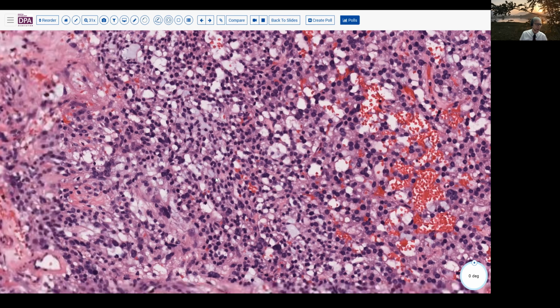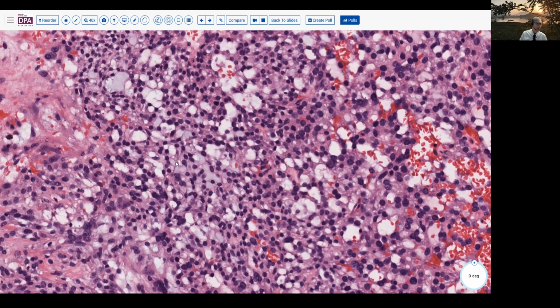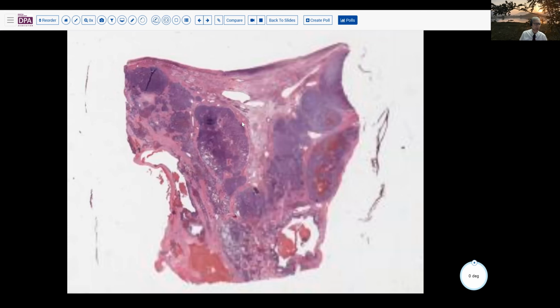We might wonder about epithelial differentiation, given a sort of bluish color to some of the cyst contents. So certainly a possible masquerading tumor with epithelial differentiation would be considered. And so we began to make a list of immunohistochemical stains that we might consider doing.